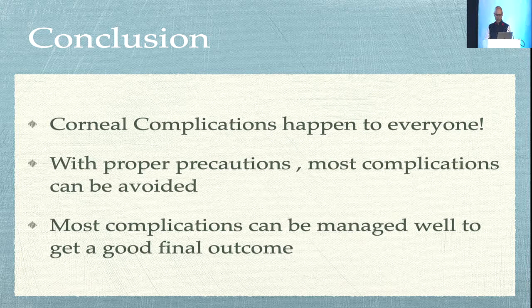So corneal complications do happen to everyone. With proper precautions, most complications can be avoided, and most complications can be managed well to get a good final outcome in most of your patients if you identify a problem in time and take appropriate measures.